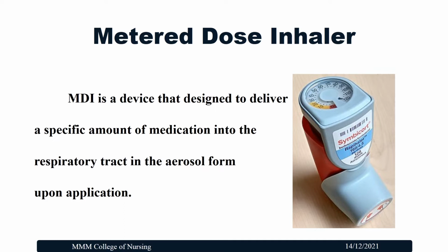A metered dose inhaler is a device designed to deliver a specific amount of medication into the respiratory tract in aerosol form upon application.